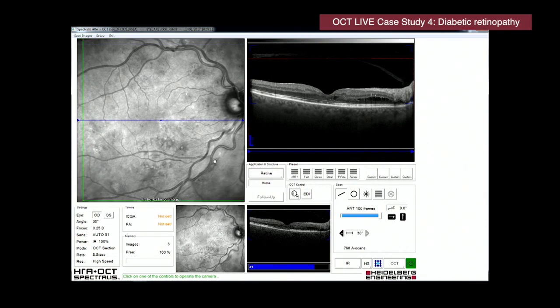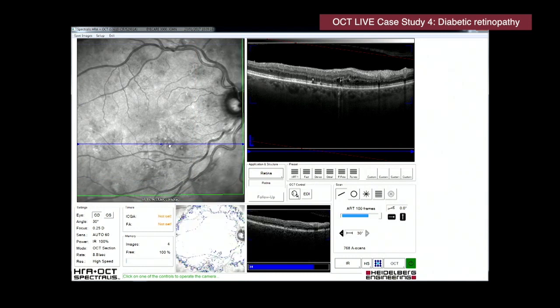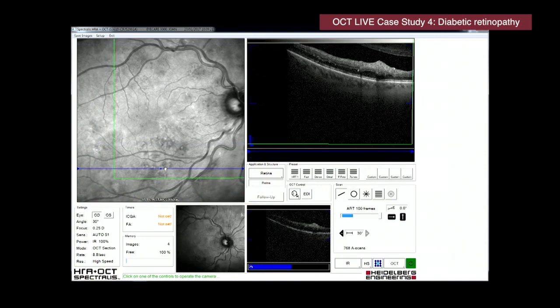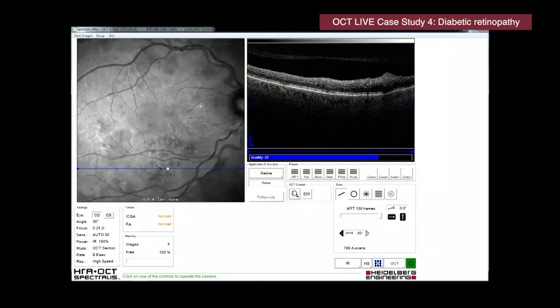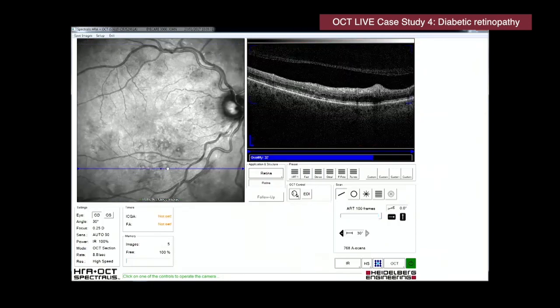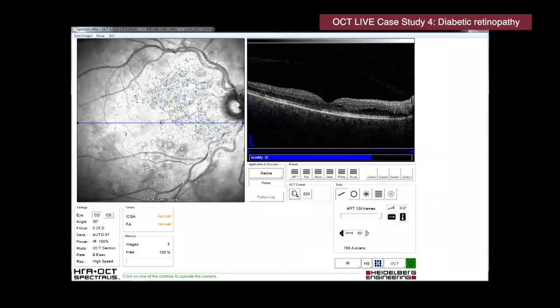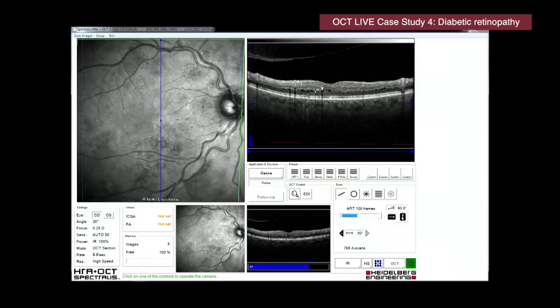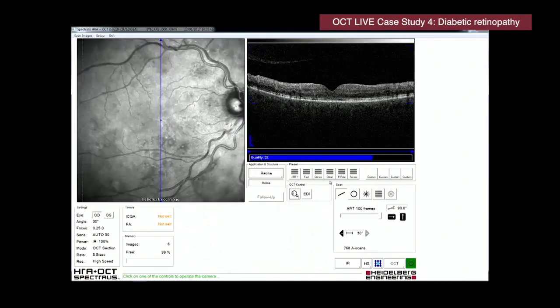So Phil, if we look at these changes inferior to the macula, just click here. And again, we can just acquire an image there. Let's move down to this spot just here, a bit further down. So exactly wherever you're seeing the changes, you can simply drop an OCT cut through. So you don't need to be an expert in interpreting the images to see that quite clearly there are some changes here and the changes that need to be documented. Again, a vertical scan. And we'll do a macular volume as well.